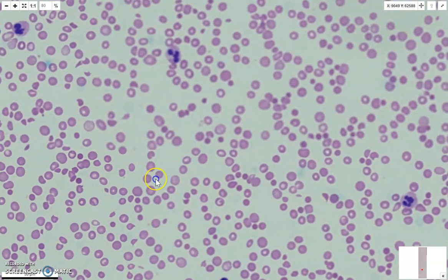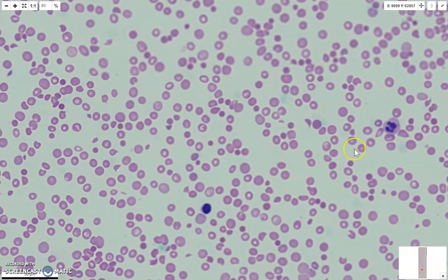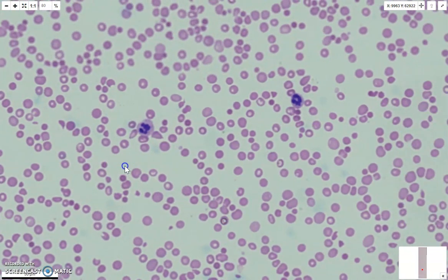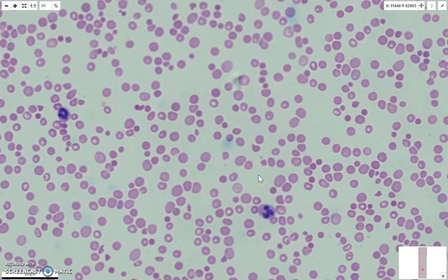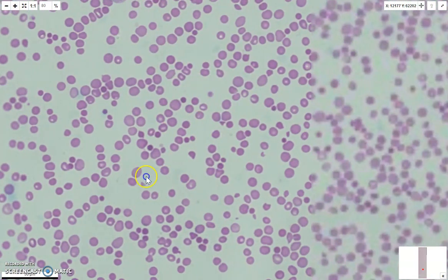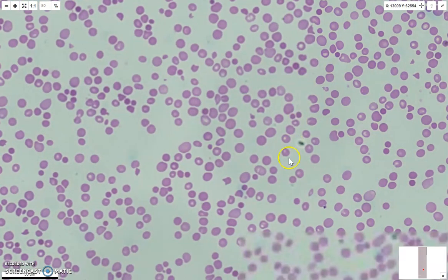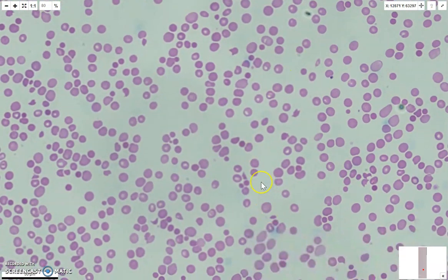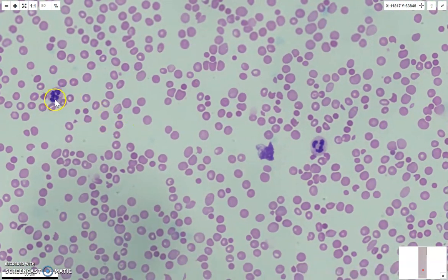Now, what also can occur with the white cells then, you would get a neutrophilia with some toxic granulation. So make sure that you count your differential there as well. And in this particular case, these guys counted 68%, but there could be more. It's not a hard and fast rule that you will get the same count as what's printed in the book. So definitely do your diff and see if you get a neutrophilia with these, because they do go hand in hand with bacterial infections such as HUS.